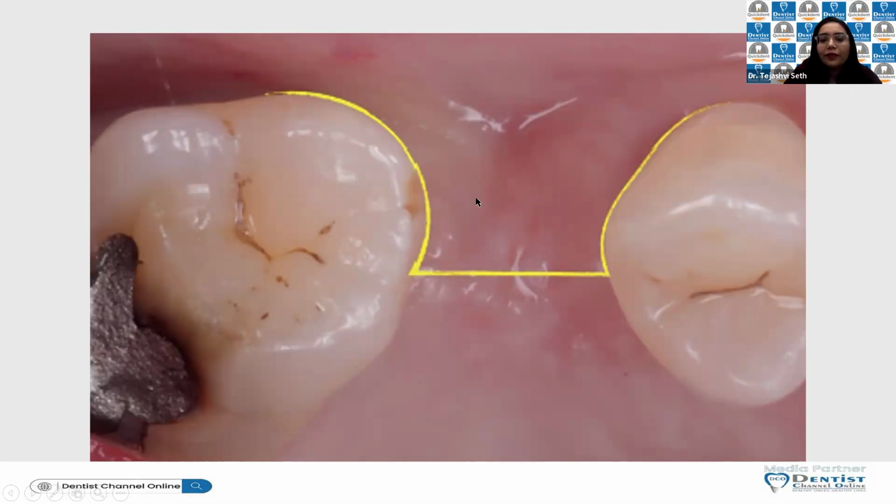Now, the mid-crestal incision in this slide is not exactly mid-crestal. The incision line is a little bit away from the buccal side. That is very simple, because if you can see, there is a depression in this area, so we want to push the tissue outwards.